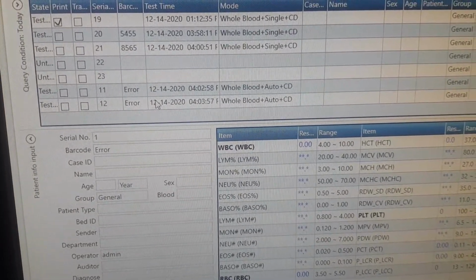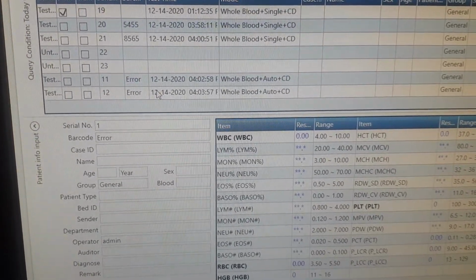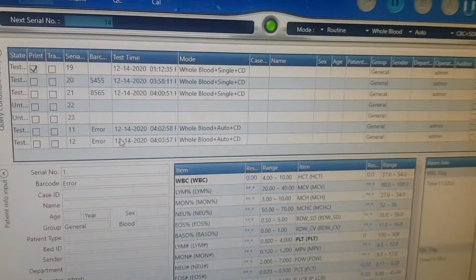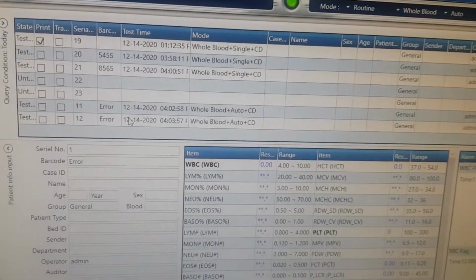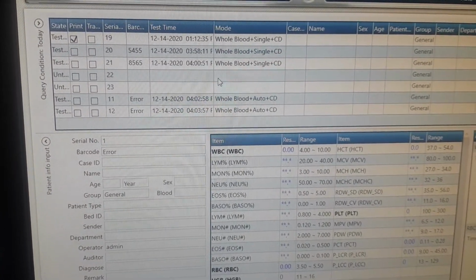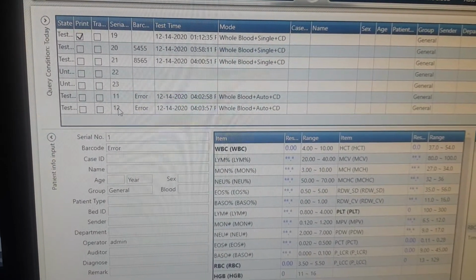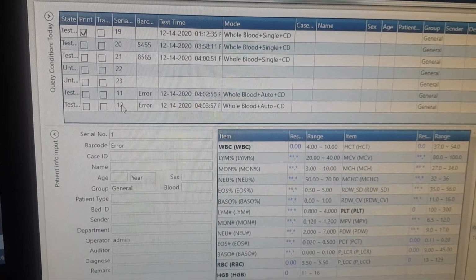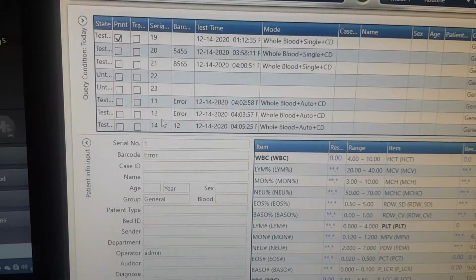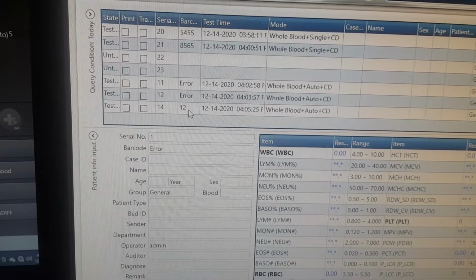And if customer mismatch some ID, they can find this way that where is the actual error. So still we are waiting. Okay, so now here you can see the position number is 14 and the barcode number is 12.